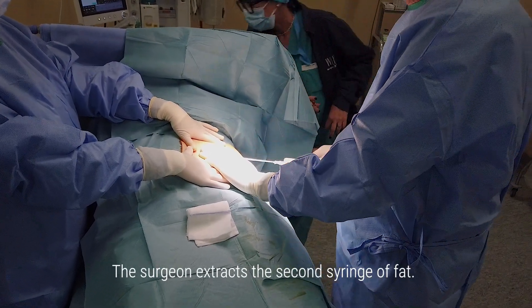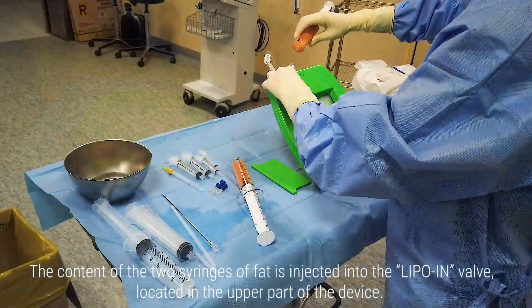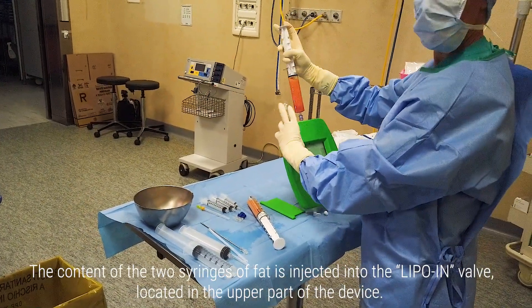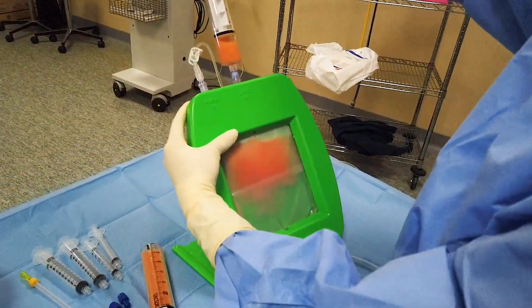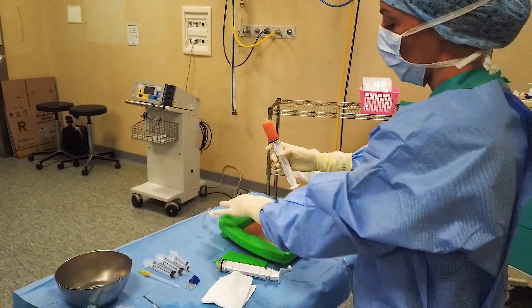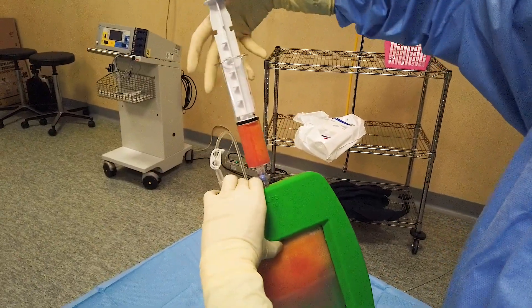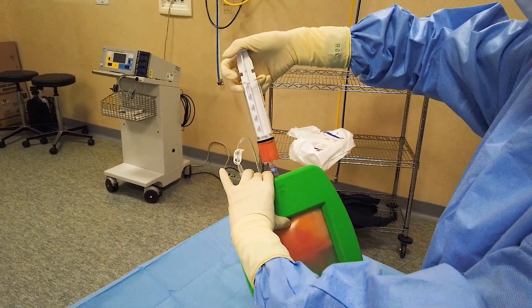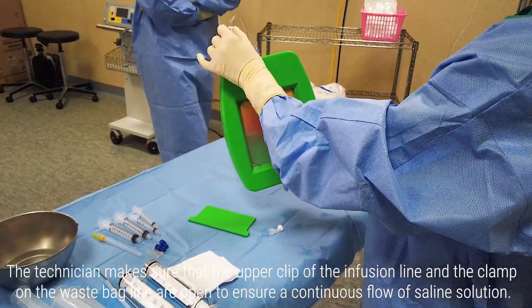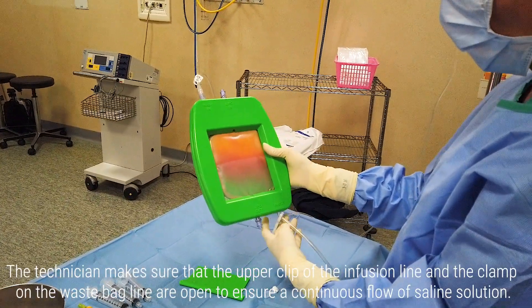The surgeon extracts the second syringe of fat. The content of the two syringes of fat is injected into the Lipo-in valve, located in the upper part of the device. The technician makes sure that the upper clip of the infusion line and the clamp on the waste bag line are open, to ensure a continuous flow of saline solution.